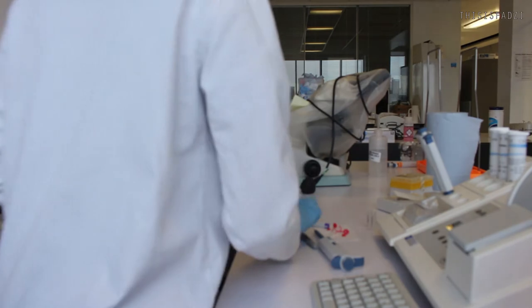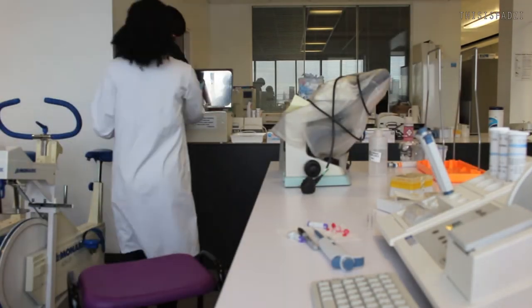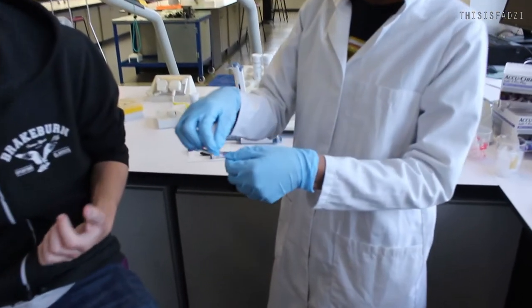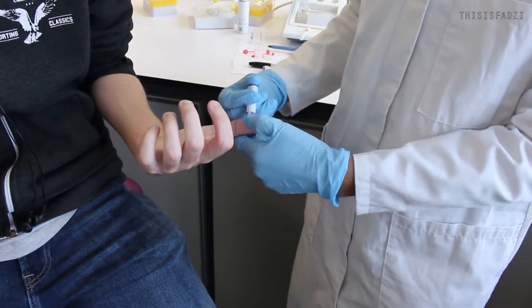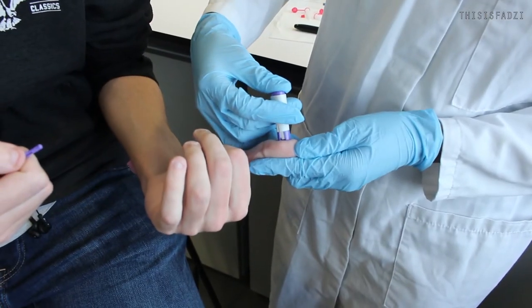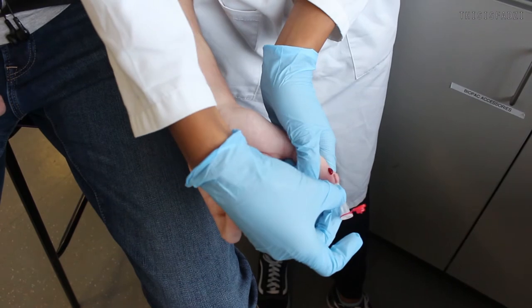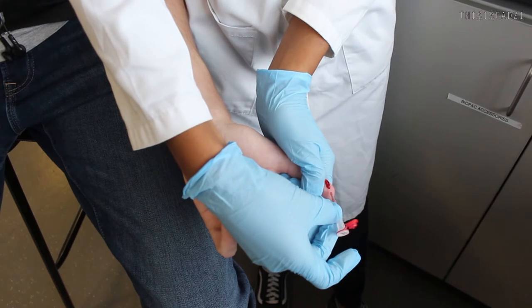Are you ready? My hand's feeling quite funny. Okay, so the first thing is the cholesterol strips. I'm going to be professional. So you just remove the little foil on it. You prick it a little bit to the side, because if you prick the middle then it hurts. Yeah, that worked. Your thumb actually bleeds very well.